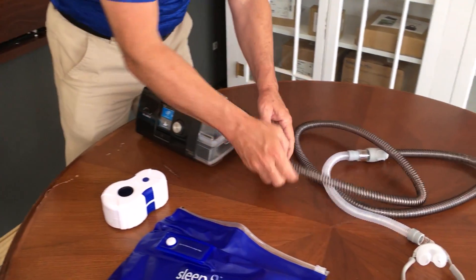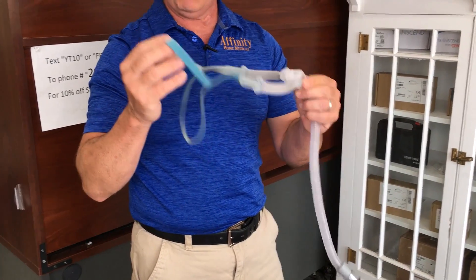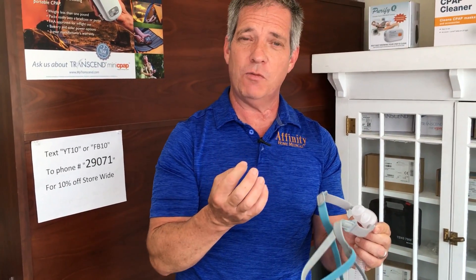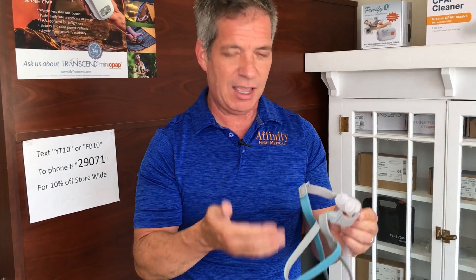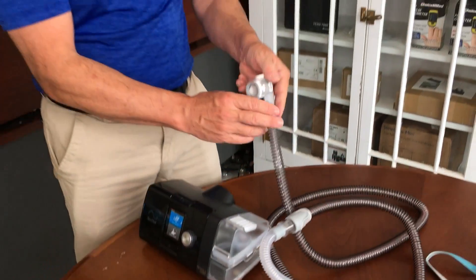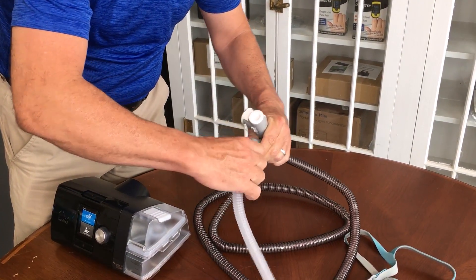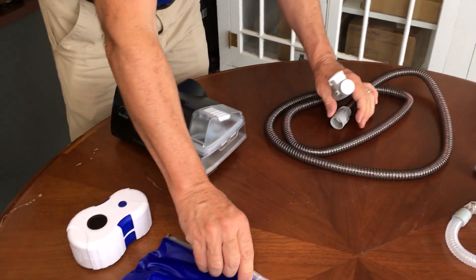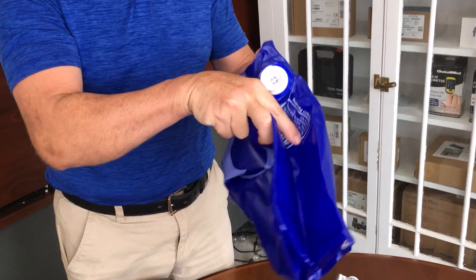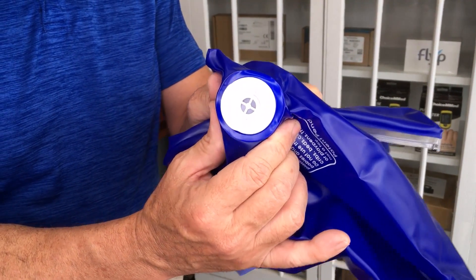Let's imagine you're using the AirSense 10 CPAP machine with this nasal pillow system. You just woke up in the morning, take your nasal pillow system off, and you want to clean your water reservoir, nasal pillows, nasal mask, and the hose. You're going to disconnect the hose — in this case, the heated hose from ResMed — and disconnect the mask as well. Now with this bag, notice that on the bottom there is a little adapter. We're going to be connecting the Sleep 8 machine to that adapter here in just a moment.